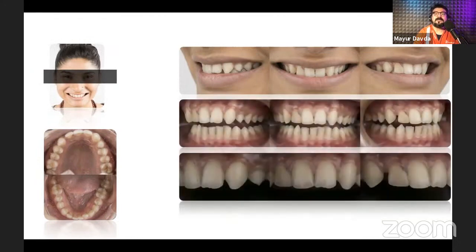Okay, I stopped that video in between because you can just have a look at me directly, because it was a little frustrating for me, listening to that video sound and telling you at the same time. So what I'm trying to say in that video is for maximum intercuspation shots. Let me go back one slide and show you all the pictures and what are the cheek retractors that we use for all these pictures.